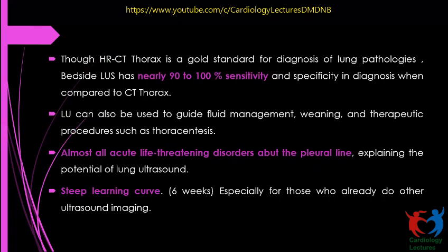Lung ultrasound can also be used to guide fluid management, weaning, and therapeutic procedures such as thoracocentesis. It can help in the therapeutic procedures also. Almost all acute life-threatening disorders abut the pleural lines. So this explains the potential of the lung ultrasound. Basically, lung ultrasound is based on the artifacts. It may not show you the actual thing inside.